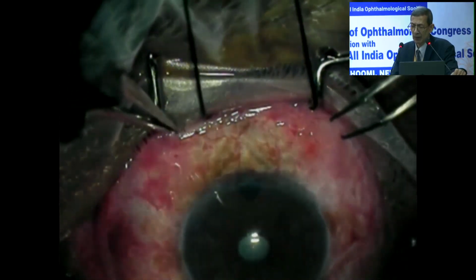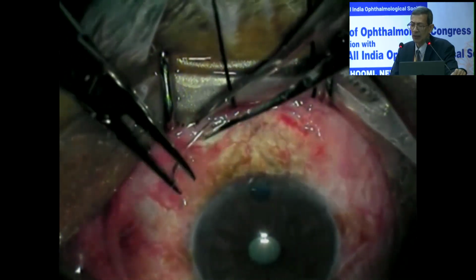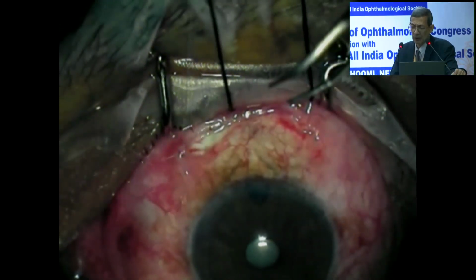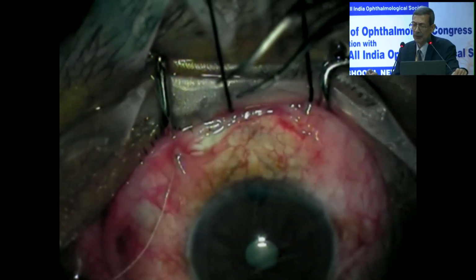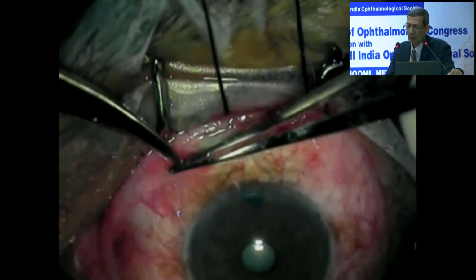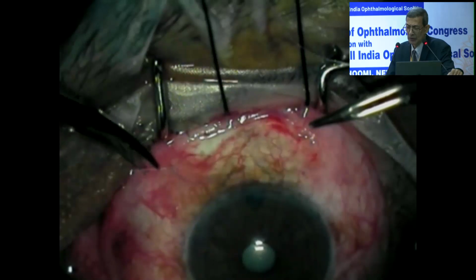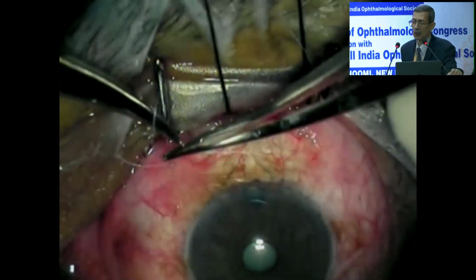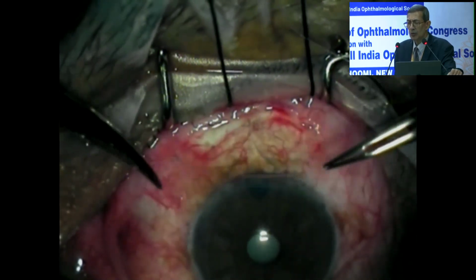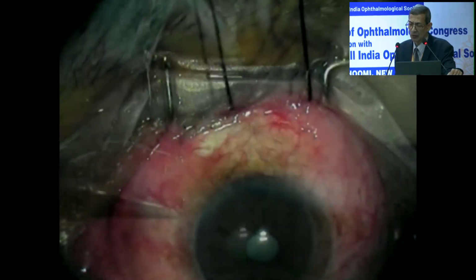conjunctival tenon layer. So this suture is a vicryl suture with a tapered, round-bodied needle. It is preferable because a cutting needle should not be used. It will lead to multiple points of leakage in the suturing area. A permanent knot is given there, 3 single throws, and then with the help of a good needle holder, with your best control, suturing from one end to the other can be done with a continuous suture.